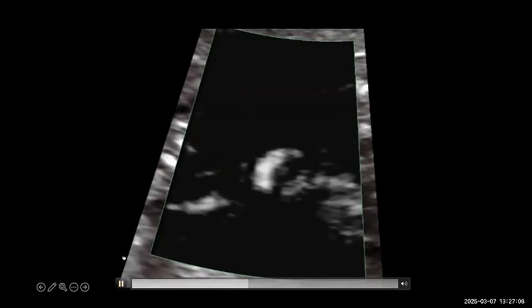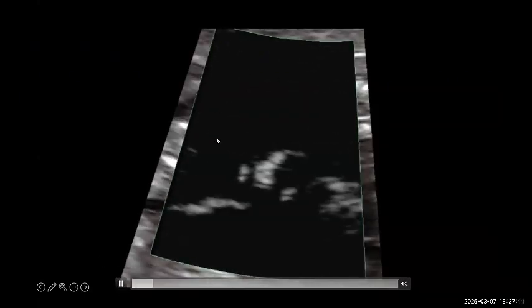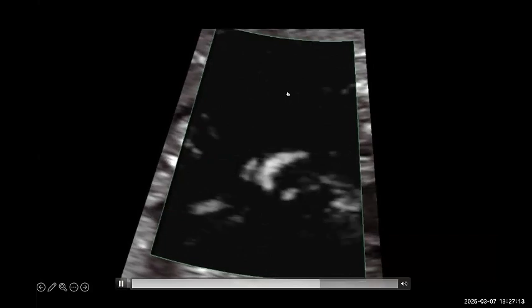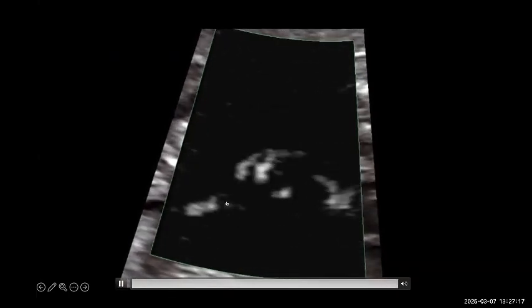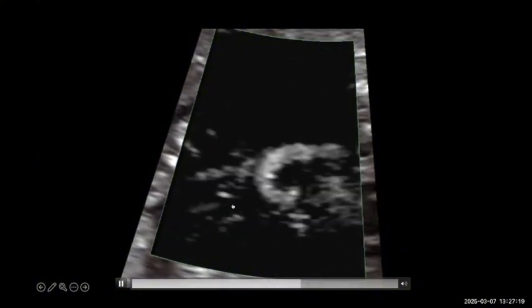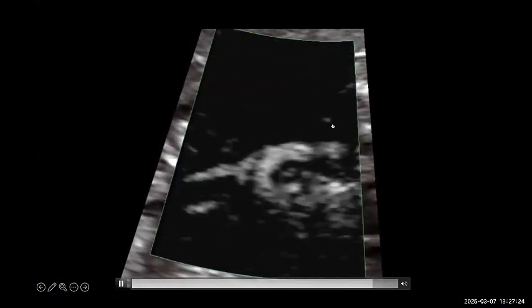This is an example of slow flow. It was an early scan at 16 weeks. We call it just flow because I decreased the grayscale just to visualize the vessel anatomy. It was quite useful. I think there is a very obvious disproportion there.